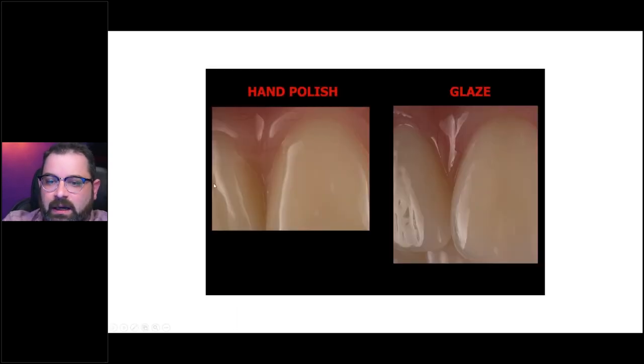Another point: when you're trying to polish by hand and you have a complex restoration, no matter how hard you try, those little areas are going to be very hard to hand polish. This restoration was glazed and you can see that it just preserves everything — especially with restorations that are going to be placed intra-orally and are not removable, like hybrids or doctor-removable only. Glazing is very important to do in those cases.